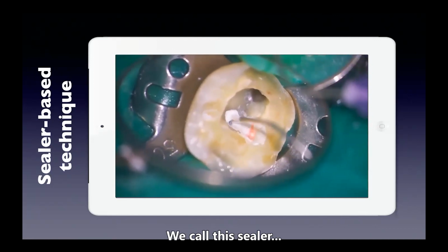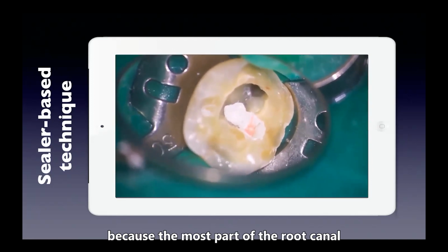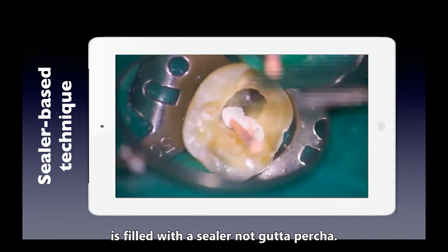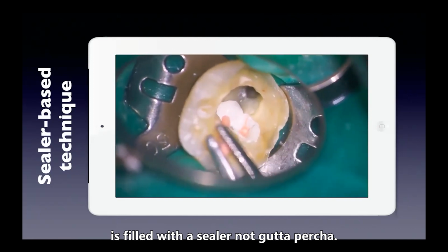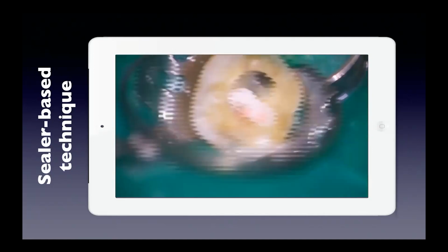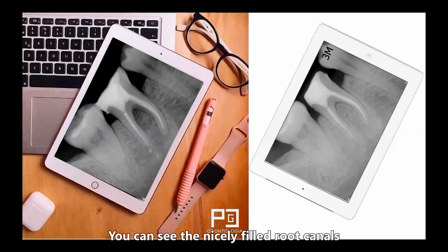We call this technique sealer-based one because the most part of the root canal is filled with a sealer, not gutta-percha. You can see the nicely filled root canals on the left X-ray image, and completely healed furcation lesion after 3 months on the right X-ray.